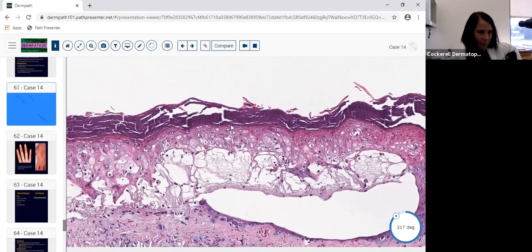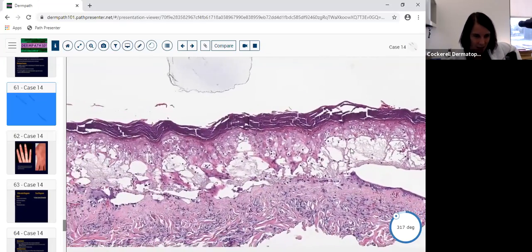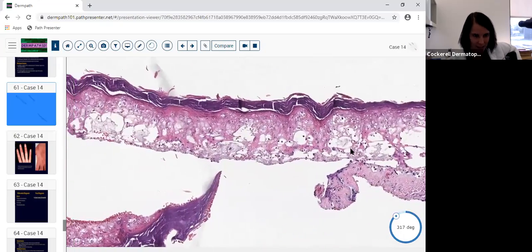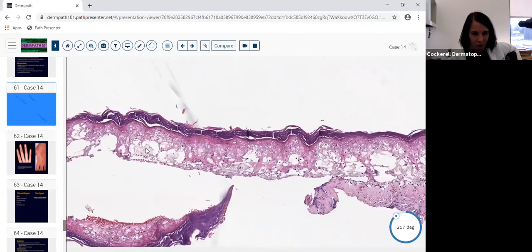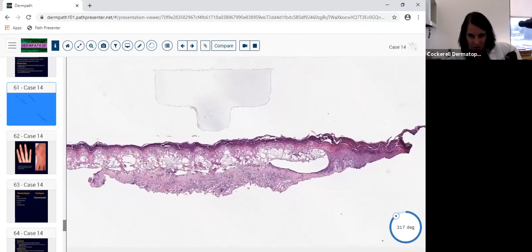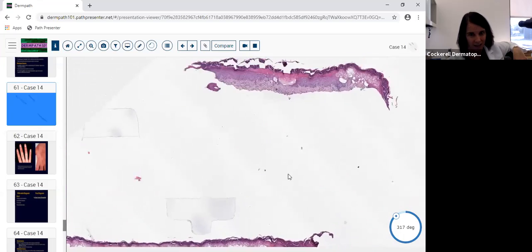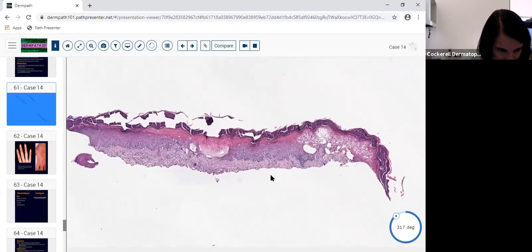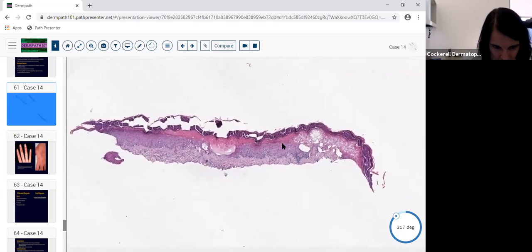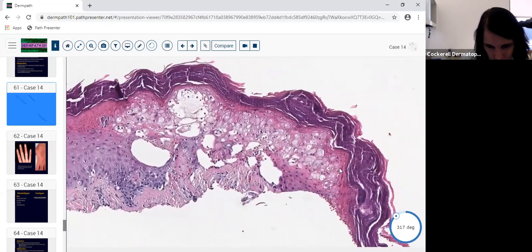And I don't believe it possibly was on the dorsum of the hand, but I believe this is actually hyperkeratosis and not just thick skin, although it might be on the hand. But this is more than you would normally see. I'm looking for a follicle to see what site they took this from. They don't always correlate with the clinical photos. The clinical photos are sometimes canned, so it doesn't necessarily correlate with this case. So I don't see any follicles. So maybe this was more, but you do see confluent necrosis here.